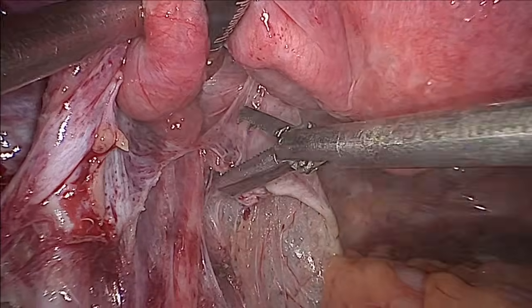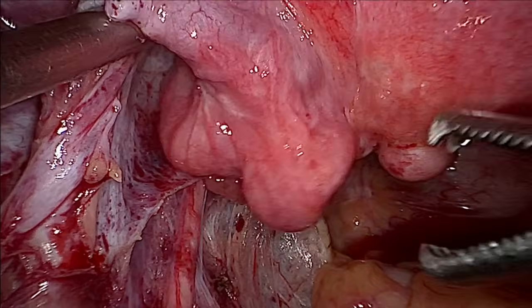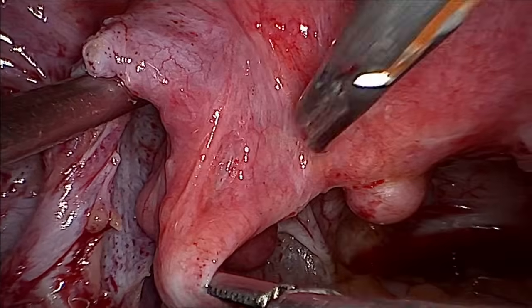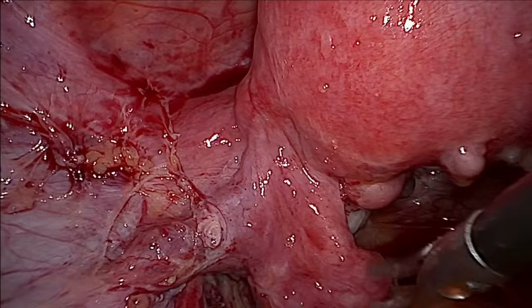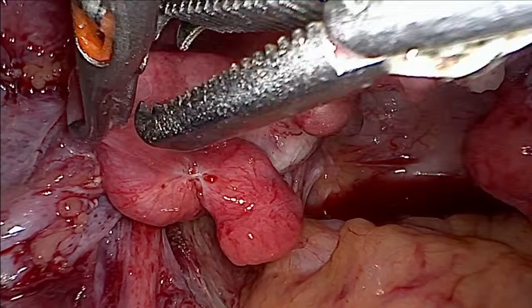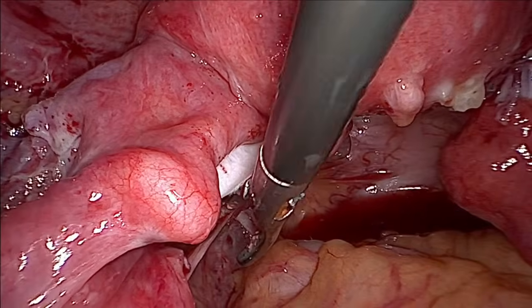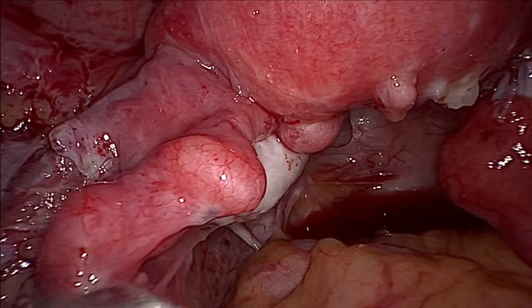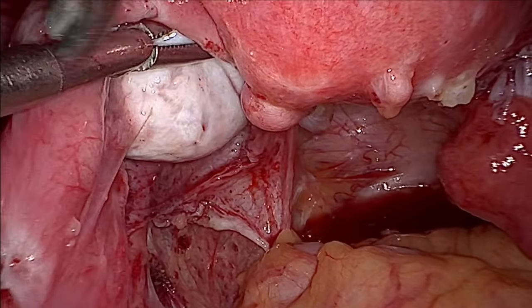This is the peritoneal fold, but now we are dealing with this tube. You can see there is this small kink sort of thing. You open it up and you can see there is active endometriosis here.